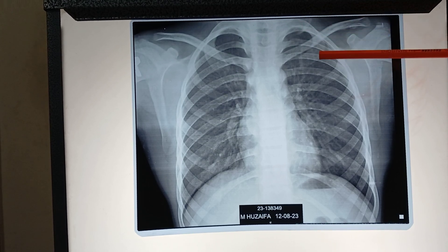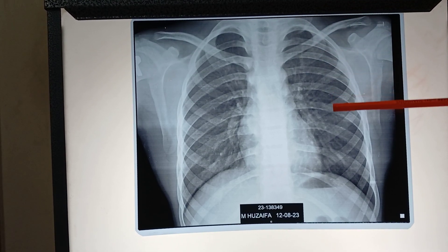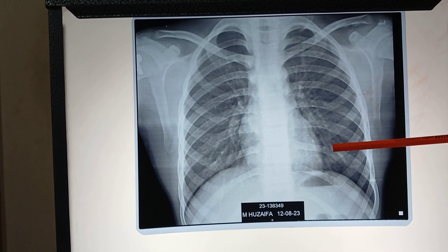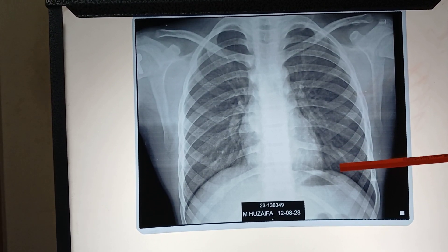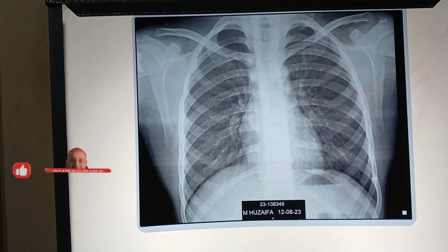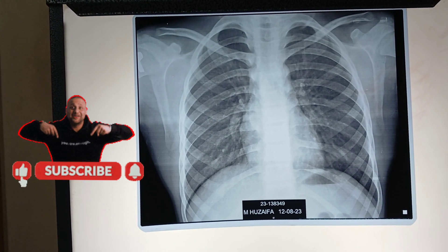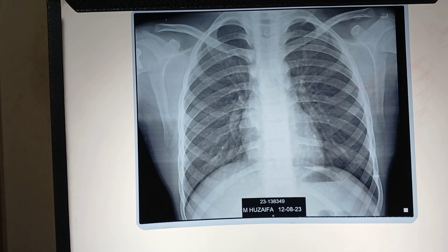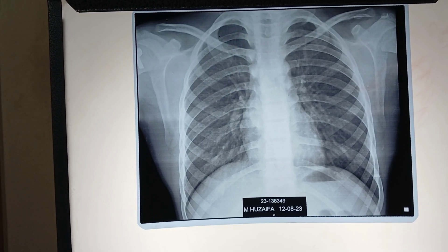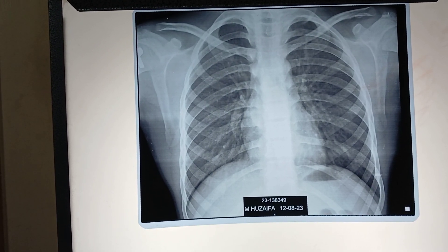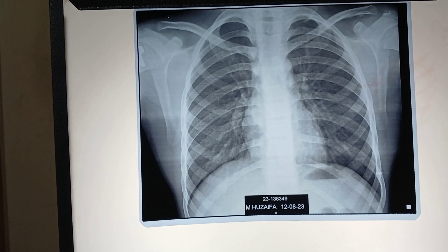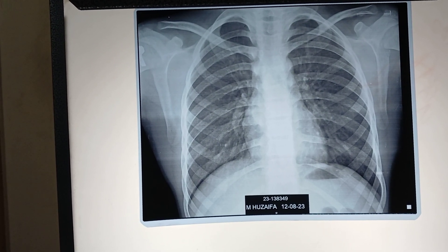Now count the posterior ribs: 1st, 2nd, 3rd, 4th, 5th, 6th, 7th, 8th, and 9th. 8-10 ribs intersect the diaphragm posteriorly. So this is the film taken in full inspiration. If fewer ribs are seen, then the film is either taken in the expiratory phase or the inspiratory effort is poor. And if more ribs are seen, then the lungs are hyperinflated.